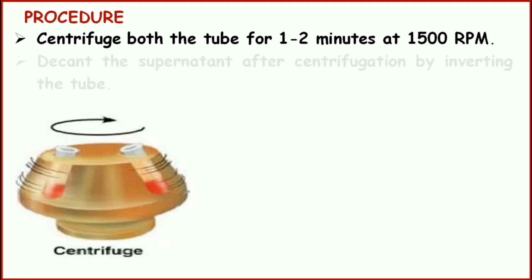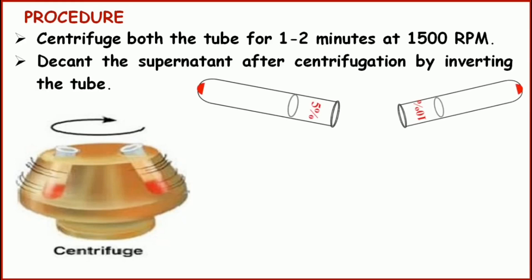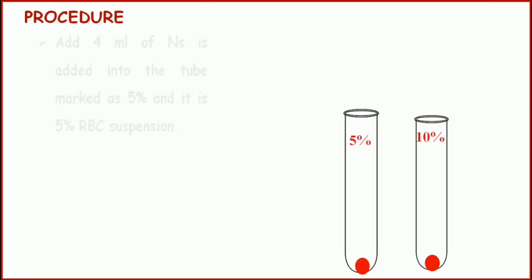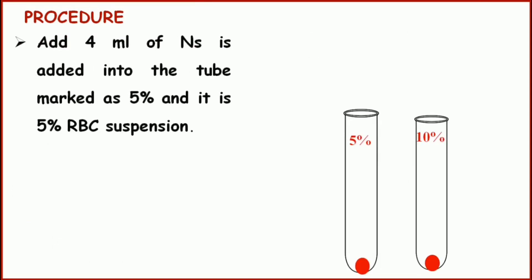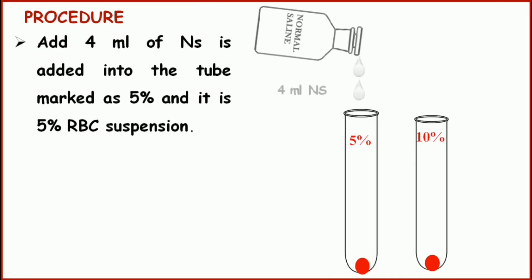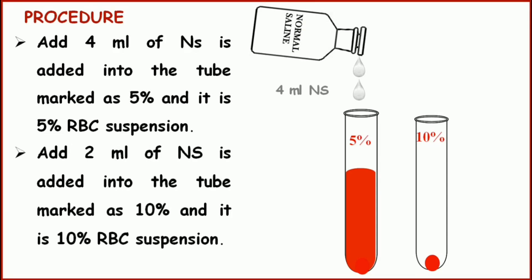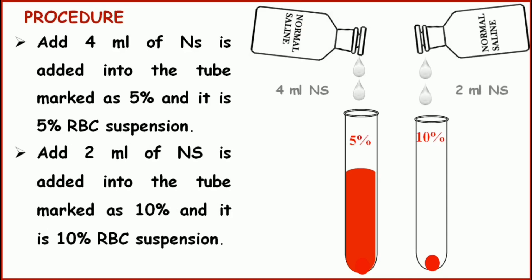Pour out the supernatant after centrifugation by inverting the test tube. Add 4 ml of normal saline into the tube marked as 5% — this will be the 5% red cell suspension. Then add 2 ml of normal saline into the tube marked as 10% — this will make the 10% red cell suspension. So now your 5% and 10% red cell suspensions are ready.